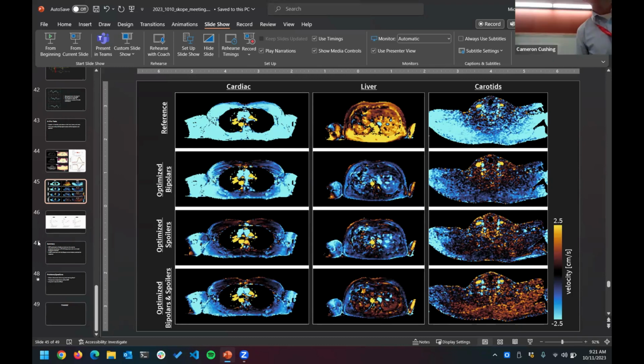Well, so the phase imaging is also sensitive to higher order. So Jumping is asking about something like second or third order terms as well.